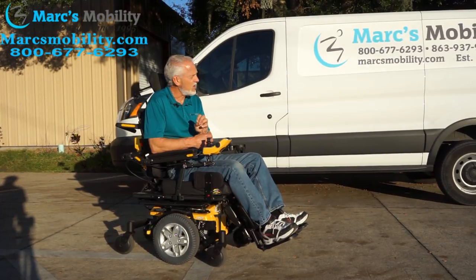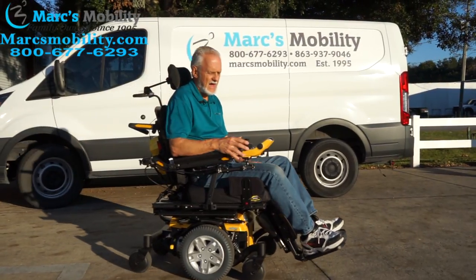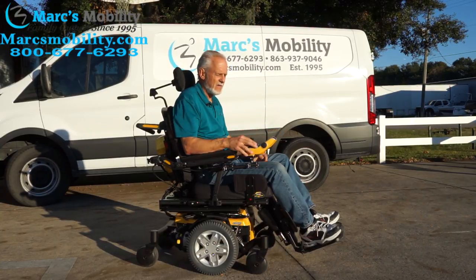Great chair with great suspension. Drives very easy, stops nice. It has electromagnetic brakes, so when you let go the brakes engage automatically on both motors and you stop within a few feet.